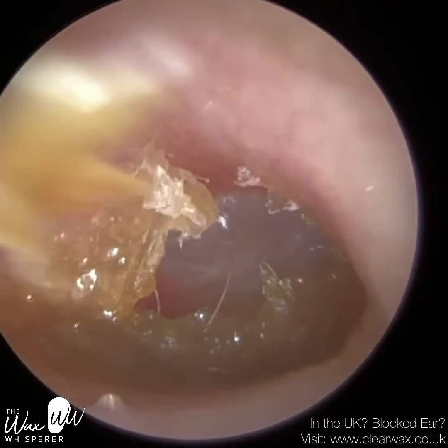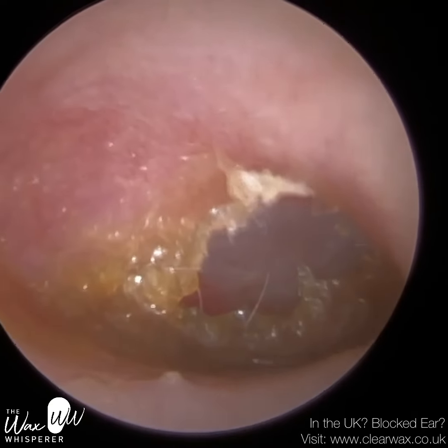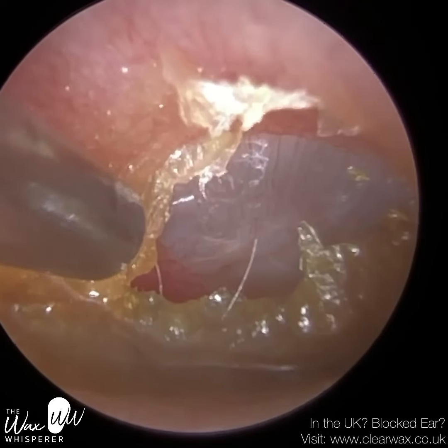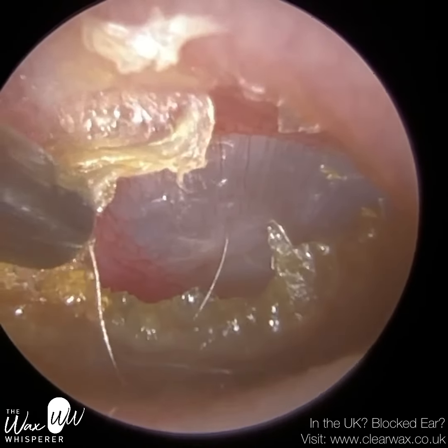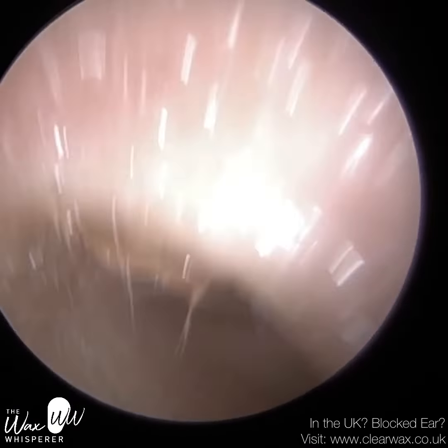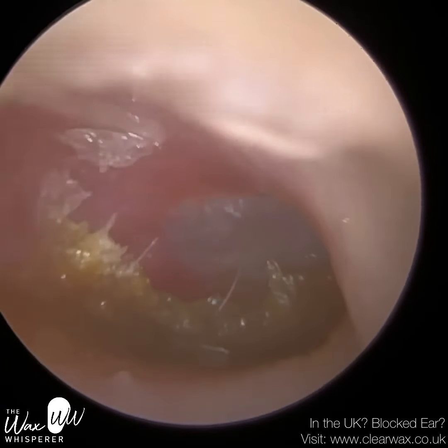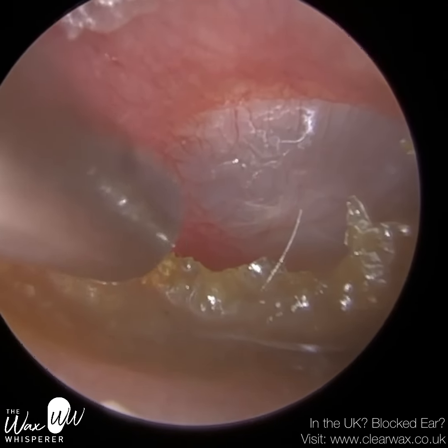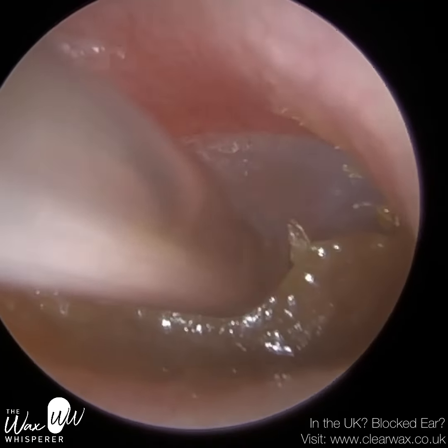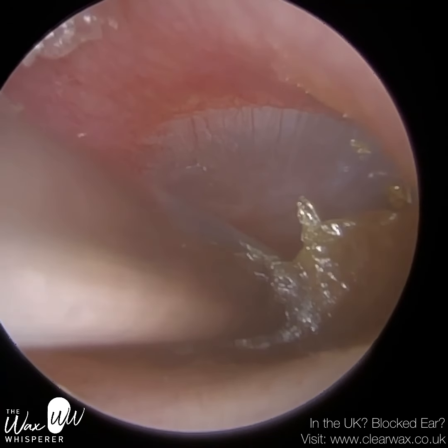Now I'm starting to peel away, so we can see the back part of the eardrum already. The reason why this skin is embedded onto the eardrum is that the outer layer of the eardrum is made up of the same skin that we're peeling at the moment. In fact, the skin was originally on the eardrum. That blue tinge you can see is that layer of skin, and this yellow dead skin that I'm removing was originally on this patient's eardrum. As the skin dies and sheds in the ear, it migrates outwards like a conveyor belt towards the entrance of the ear.